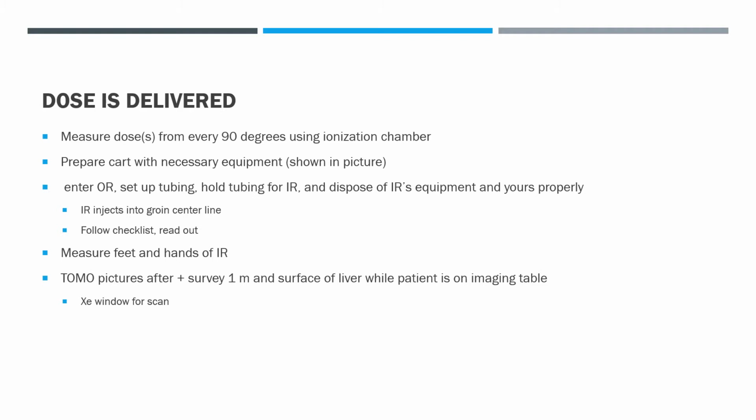It comes in this, it's unfortunate because I was going to show you guys. They kind of gave me a Therasphere container that's completely dead, like it all decayed away and everything, but they gave me the container that the dose comes in, and basically it's like this little cylinder container.